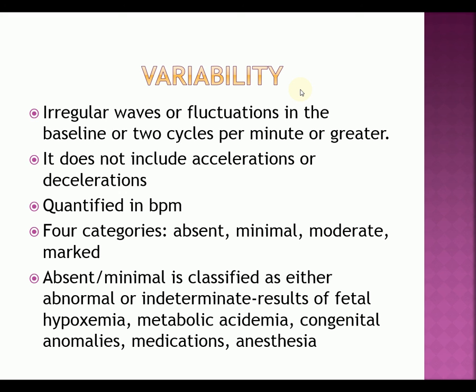Moderate variability indicates that your fetal heart rate regulation is not affected by fetal sleep cycles or anything like that.